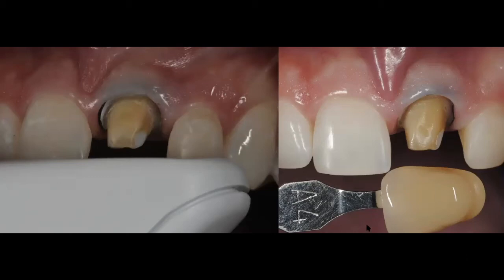And in this case, you can see how dark, A4, and it matches. It's very close to matching, but you can see how dark that stump is. Why is this important? Because now the lab technician knows and understands that they're going to have to fabricate a stump with that shade in order to try their crown and make sure that they're going to be able to deliver a crown whose basic shade, if it's going to be lithium disilicate in combination with that stump shade, gives you the result that you're looking for. In this particular case, look at number 8. Look at how high value that tooth was.